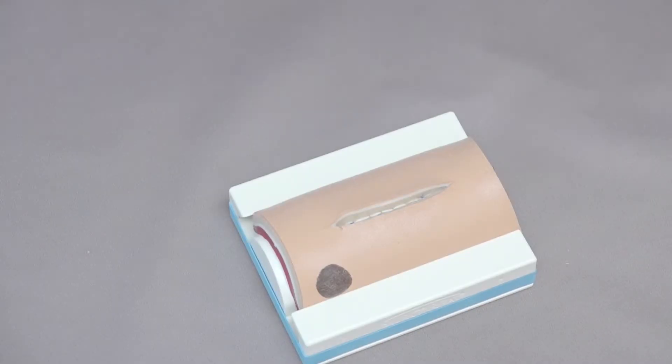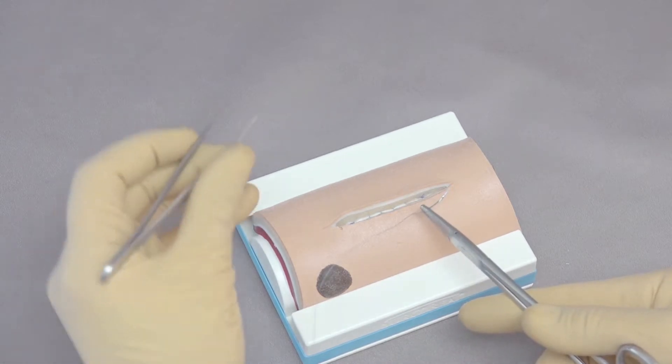Now to close the intradermal area or the skin in this one, this model is designed to actually be able to use to close an intradermal pattern. So to do the intradermal pattern we want to bury our knot.